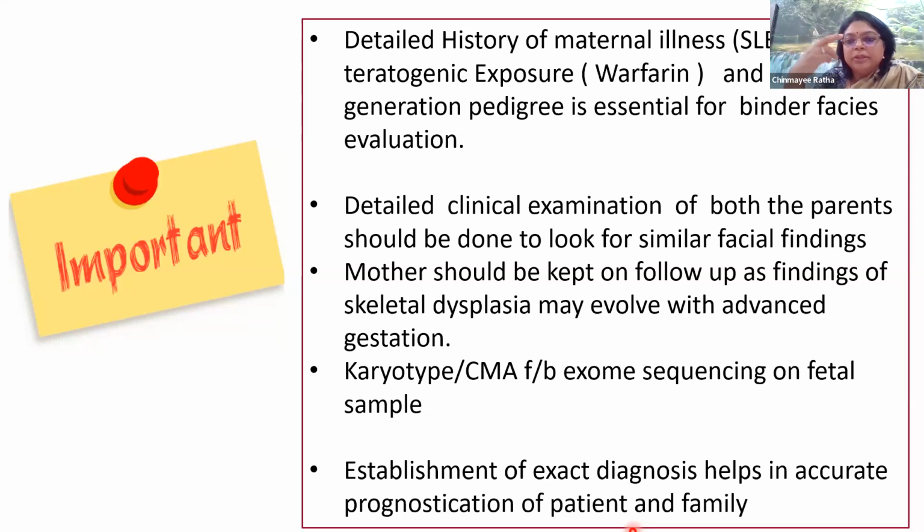Sometimes when the nasal bridge is very depressed, there is definitely a possibility of compromise of the upper airway. The literature suggests this. We had one case where it was very flat on the antenatal ultrasound. We were not able to see the nostrils also. But after the baby was born, the literature says you should put in nasal prongs to keep the upper airway patent. Now, our neonatologist put a steri strip by pulling up the forehead of the baby a little bit.